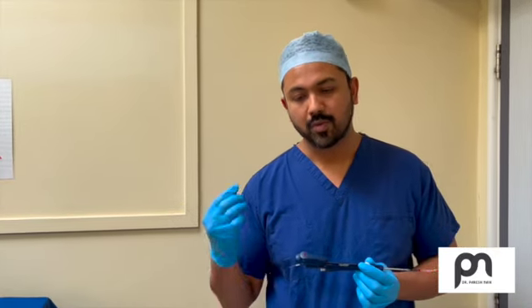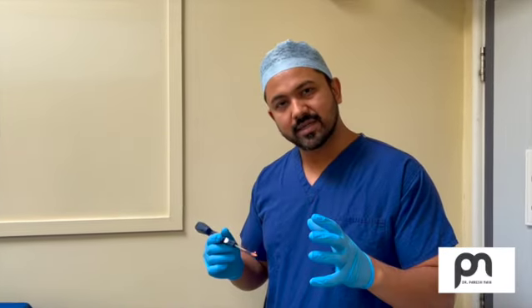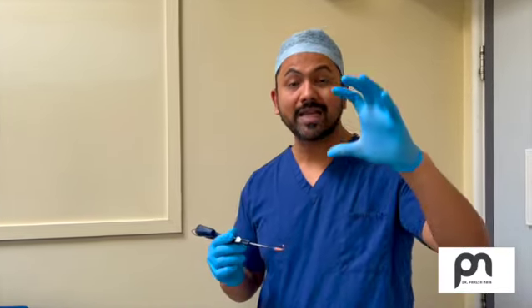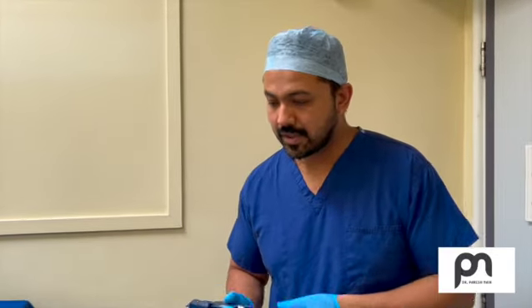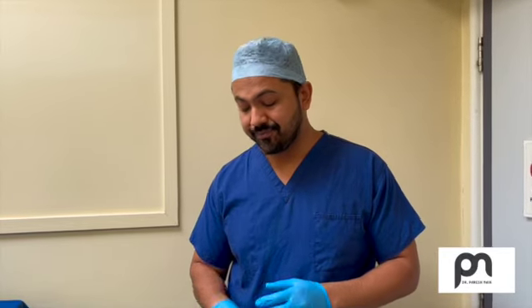Now, in balloon dilation, we go inside the nose. It can be done under general anesthesia or local anesthesia. You go into the sinus, you use a balloon to dilate it, like esophageal dilation or any other dilation. You dilate it, keep the ostium patent, okay? The effect will last for maybe months or years. I have seen patients who have had balloon dilation for 2 years and they are fine. They don't have any issues with sinuses, there's no sinus collection. Obviously, it has to be planned and managed with other medical management, maybe the sprays, steroids, or nasal douching regularly.